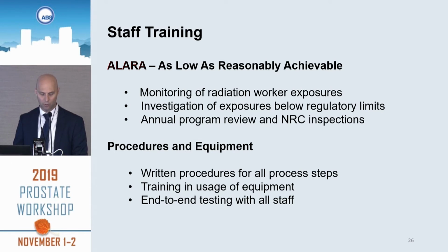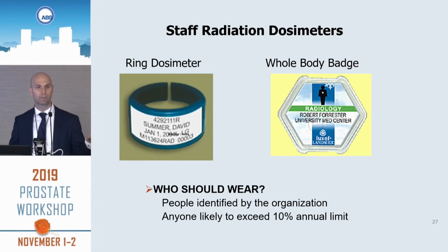All process steps and equipment should have written procedures. I counted our LDR and HDR procedures at Mayo Clinic, and we have over 400 different procedures. We have a process for creation of documents, for review of an initial document, as well as for updating documents, and editors who are responsible for those. You'll get a chance to work with some phantoms throughout the rest of today and tomorrow, and you can use those phantoms for end-to-end testing. I think that is a fantastic way to ensure that your quality is being met.